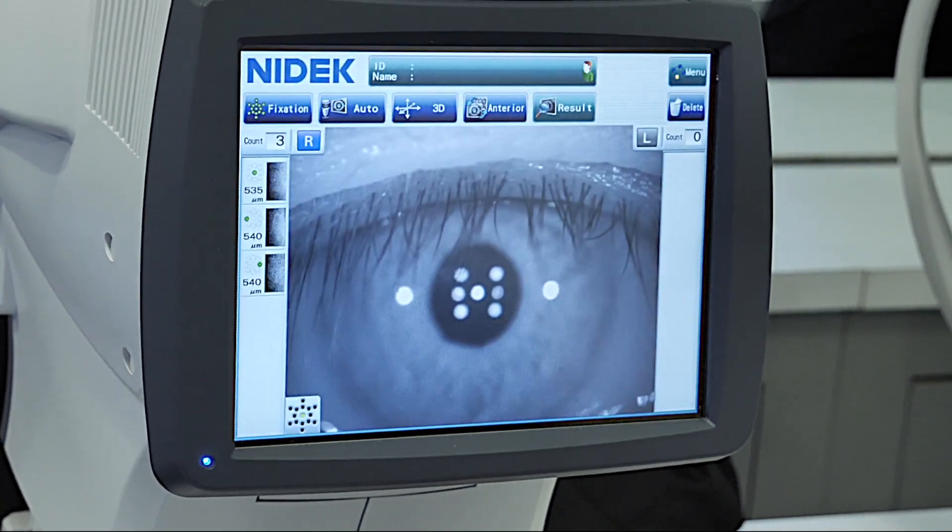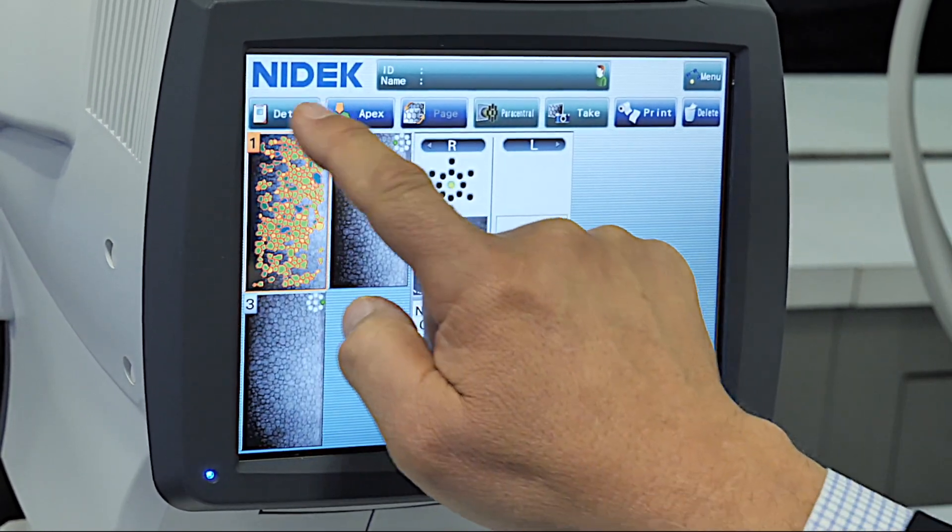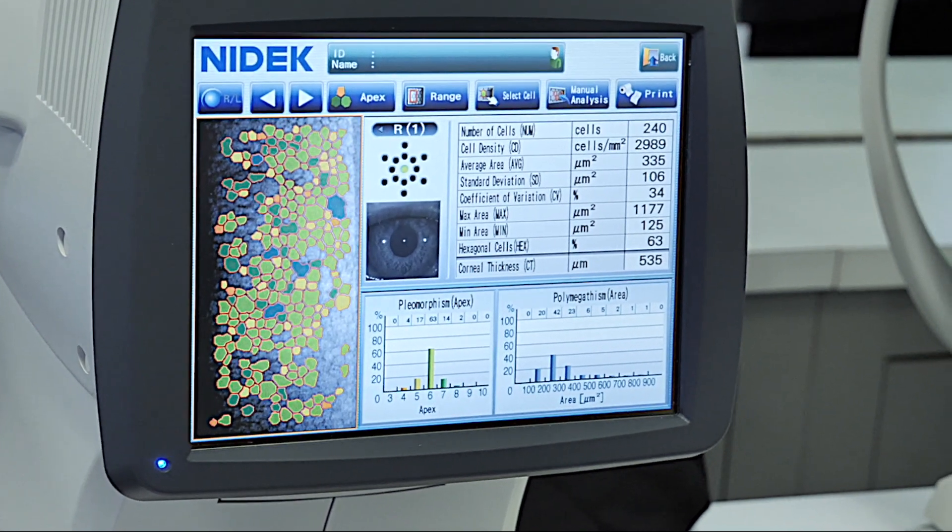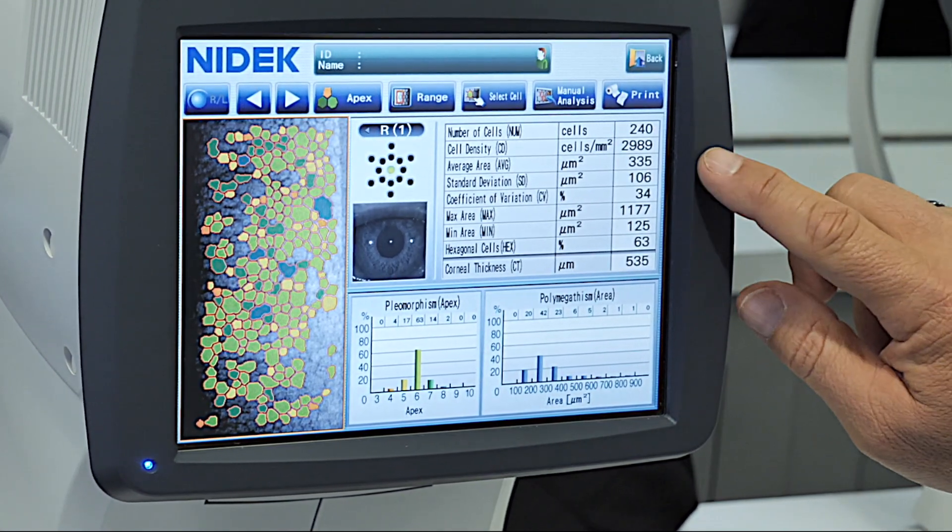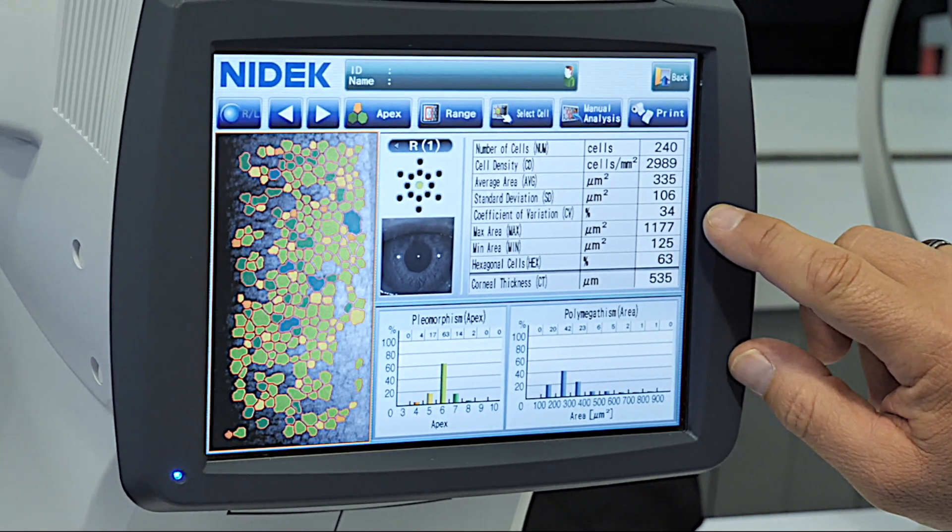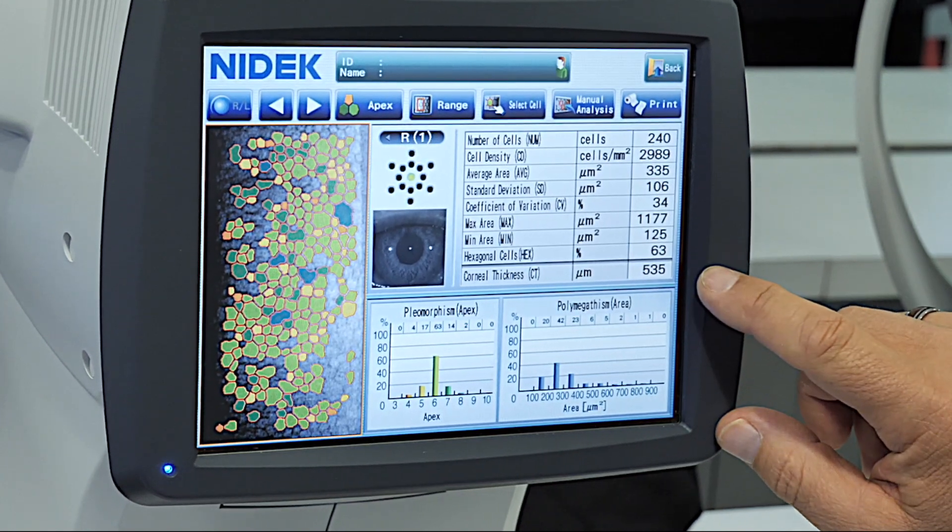After the exam is complete, we're going to look at our results. In the result page, we're going to see the endothelium number of cells, the cell density, the average area, standard deviation, coefficient of variation, the largest cell, the smallest cell, the percentage of hexagonal cells, and corneal thickness.